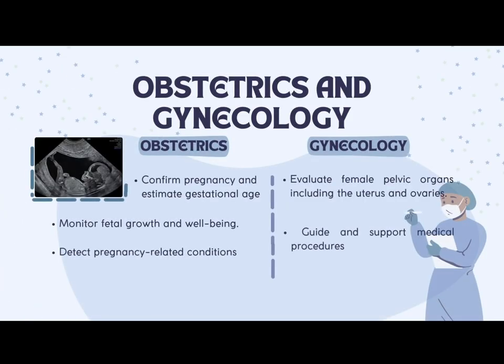First of all, in obstetrics, ultrasound is used to confirm pregnancy and estimate gestational age by detecting a viable fetus and determining the due date, especially in early pregnancy. It also helps monitor fetal growth and well-being by checking the heartbeat, movement, and organ development. It is also used to detect pregnancy-related conditions such as multiple pregnancies, placental problems, and congenital abnormalities.